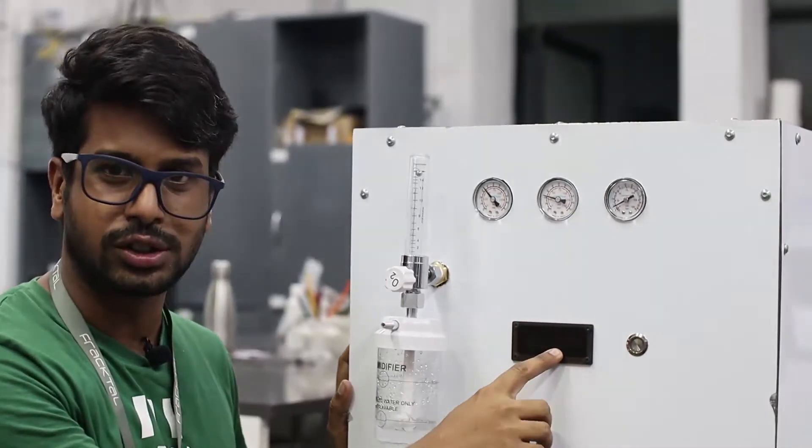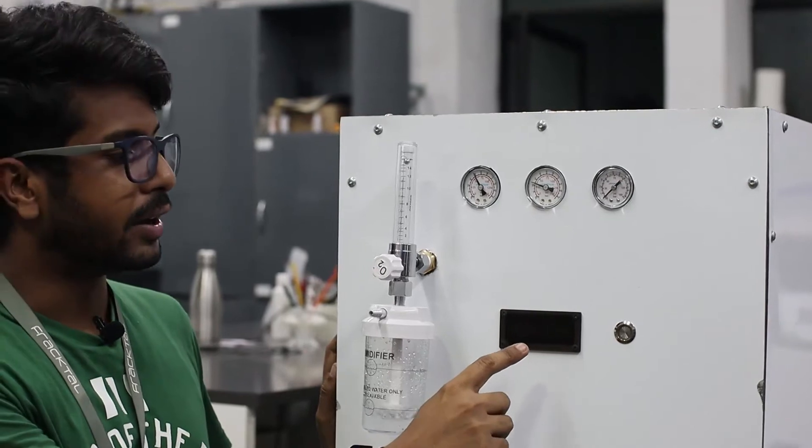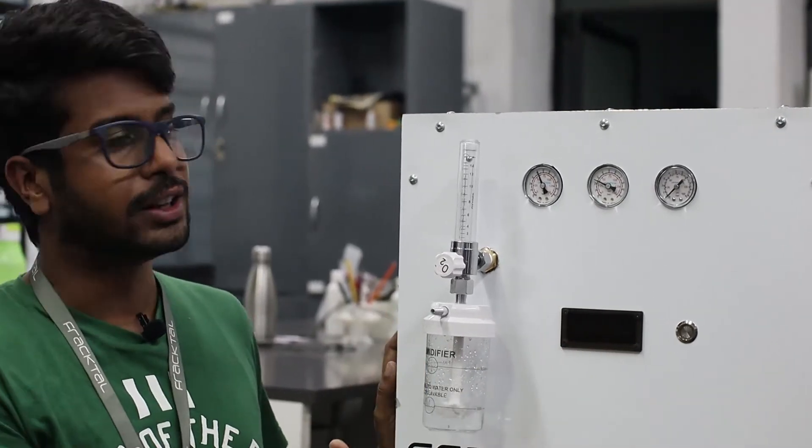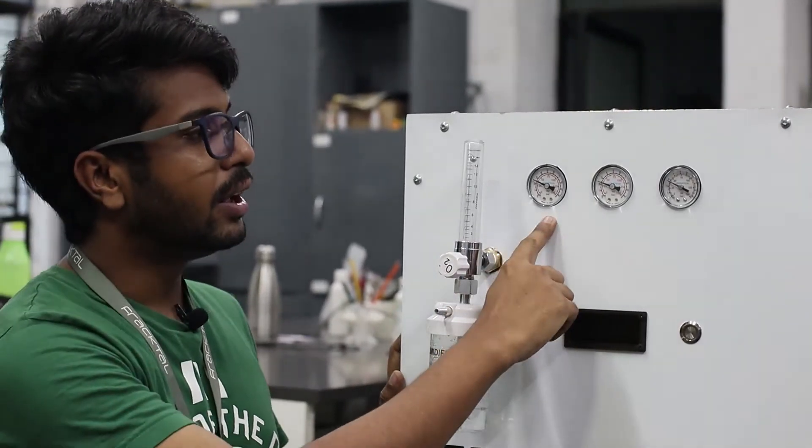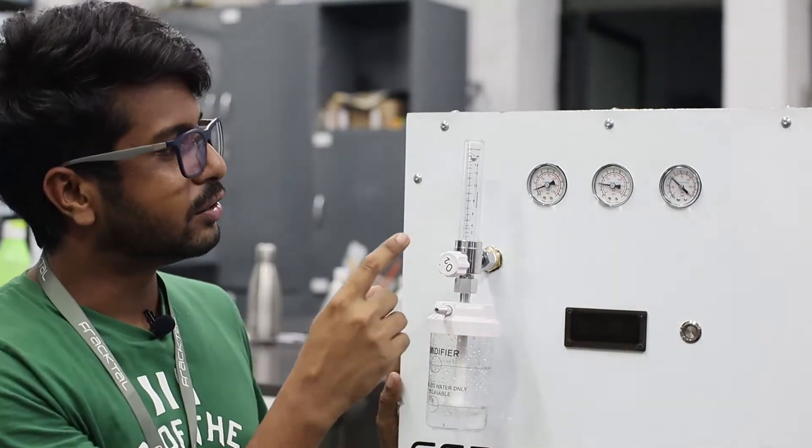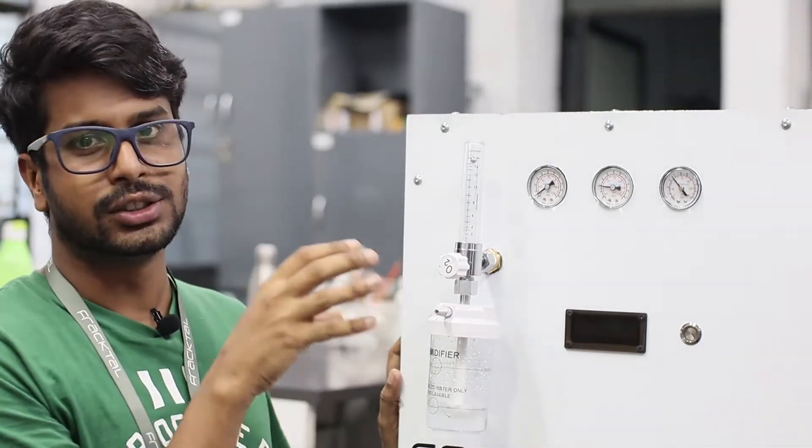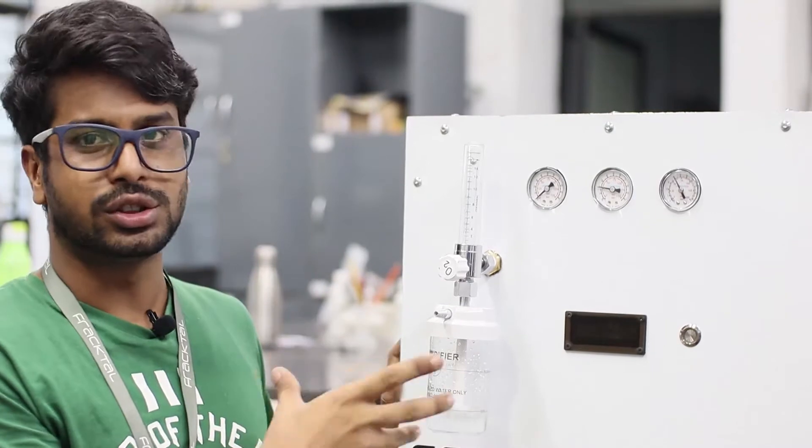We have a display up front which displays the oxygen concentration percentage and any alarms about anything wrong in the machine. We also have the pressure dials that are showing the critical pressures of the PSA system of the oxygen concentration.